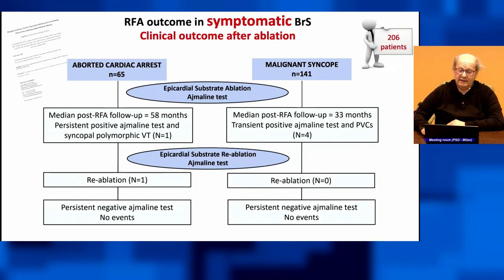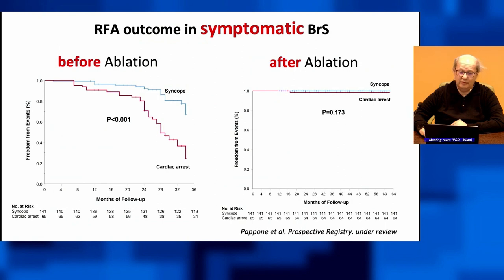very clear. Regarding the results on the follow-up, we did the reablation in only one patient, but after the reablation, he was completely ajmaline negative. So 100% of the patients after the ablation don't show any clinical manifestation and any electrogram aspect of Brugada syndrome.